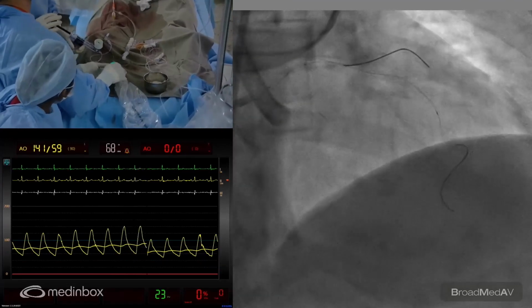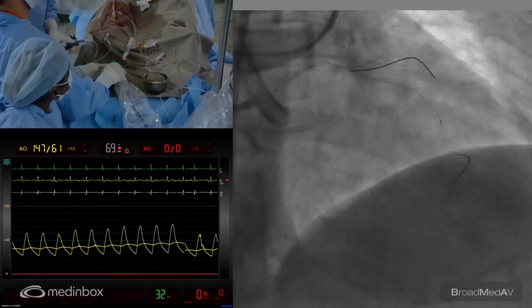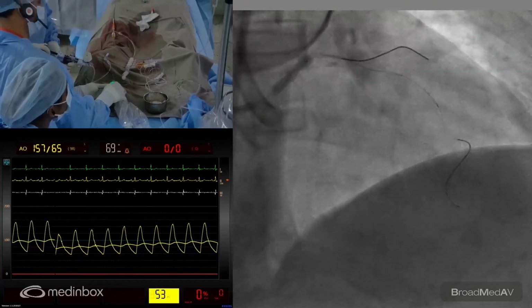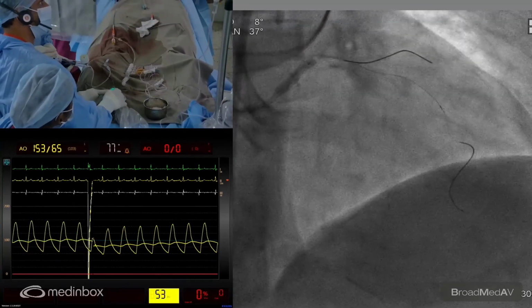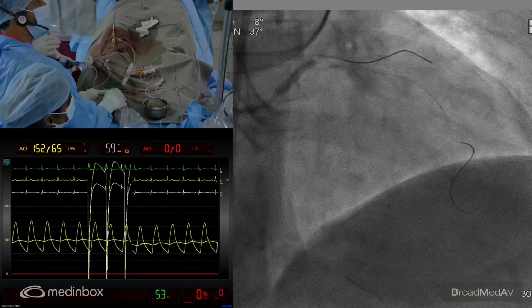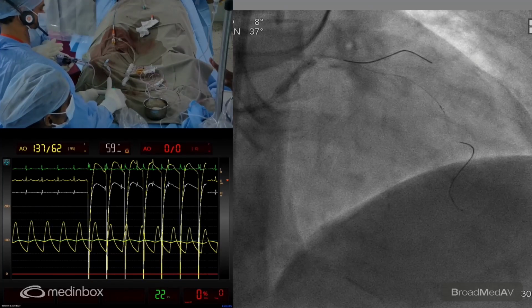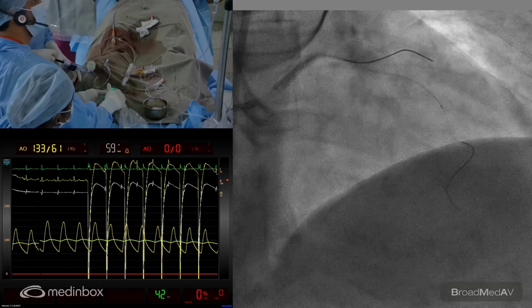So we're going to do that. So we need to now go up again. We are up to 4 now. Press, sir, please, continuously. You can hear the noise now of the pulse, and you can see the pressure pulse there. Continue the pressure.